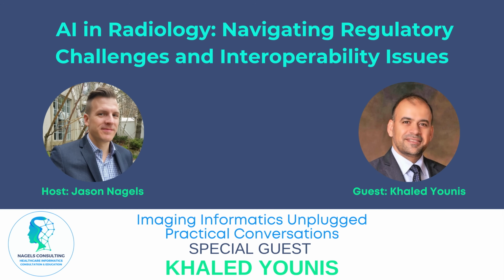For example, I told you about the AI risk management standards by ISO IEC JTC 1 Subcommittee 42, but we also have very nice work done by NIST, the National Institute of Standards and Technology, where they laid out a very detailed report on how to tackle these harmful biases, which was referred to in their other publications about AI risk management guidelines.